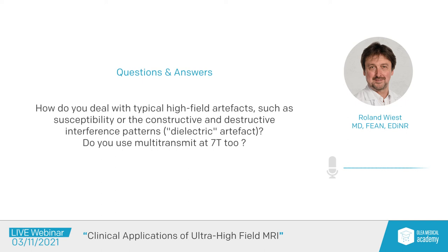No, we try different approaches. We try to apply the dielectric pads in order to overcome this in part. Well, for our questions, it has not shown to be really too helpful. It has not improved the situation. And for the clinical patients, we just have the clinically certified coils. So therefore, I think we need to keep this kind of artifacts at the moment as one of the, and this is an important comment, one of the drawbacks.